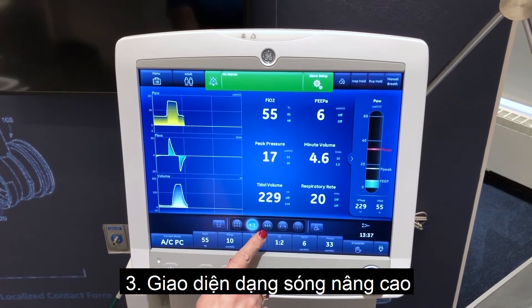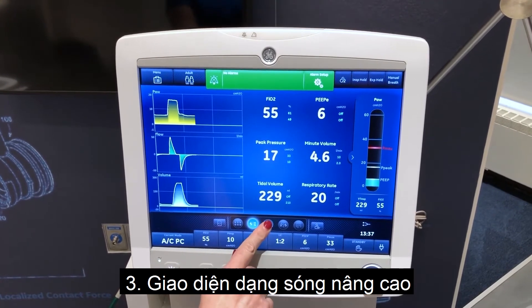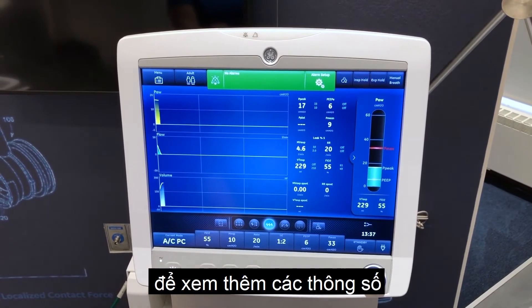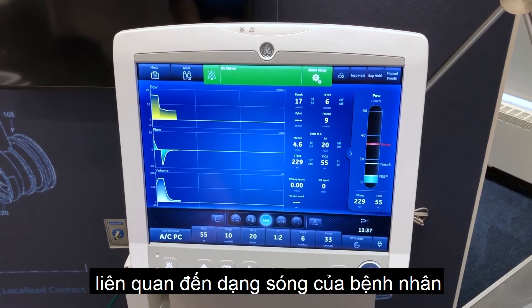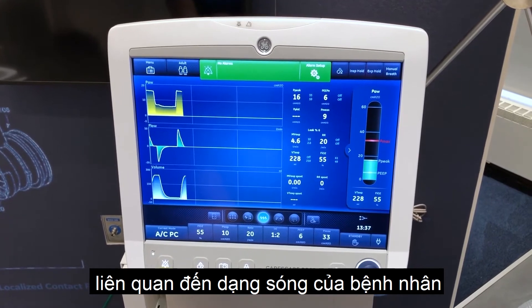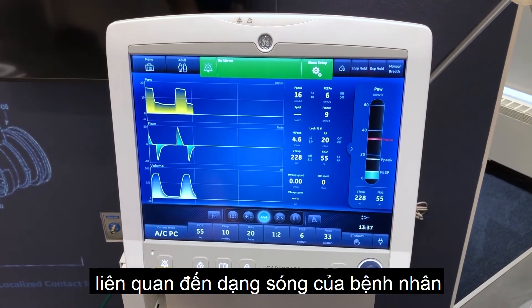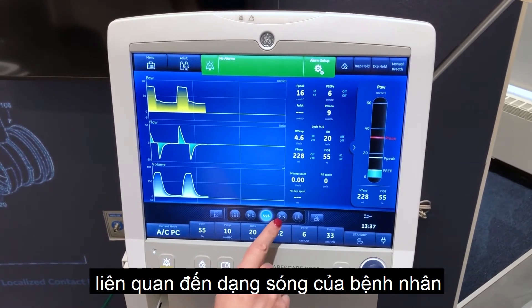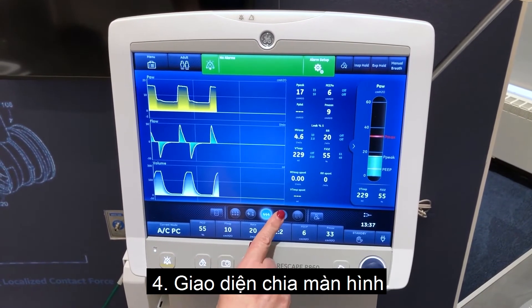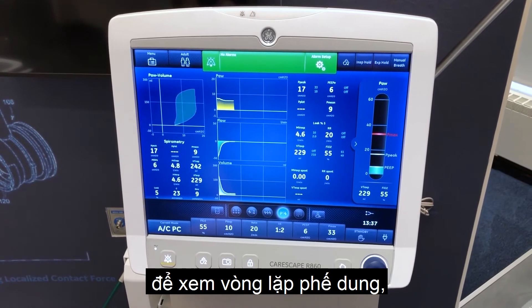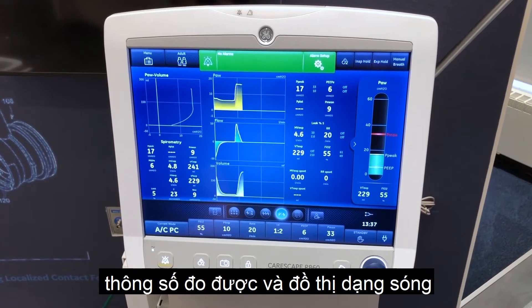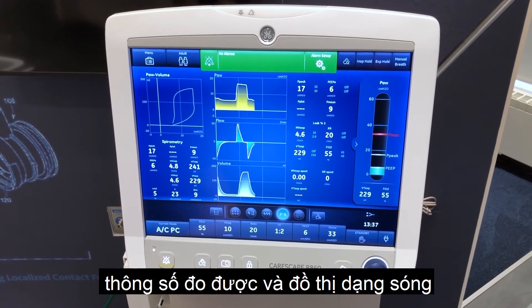Advanced waveform view to see additional measured data associated with the patient waveforms. Split screen view to see spirometry, measured data, and waveforms.